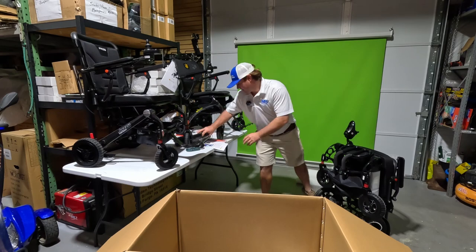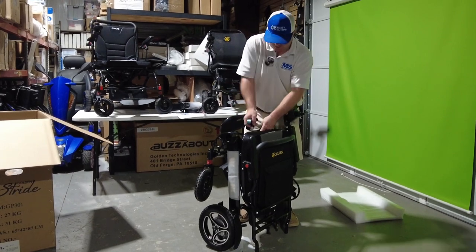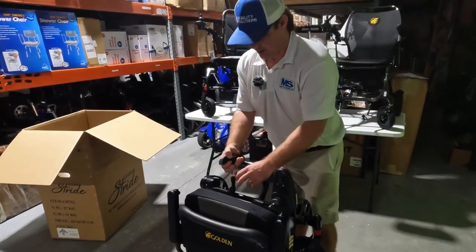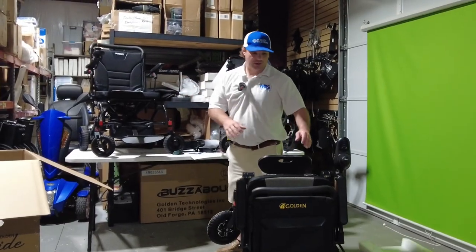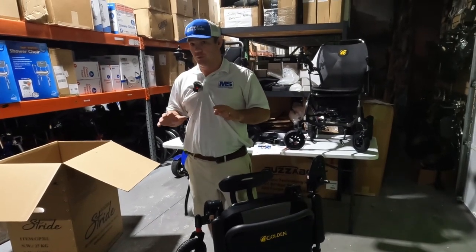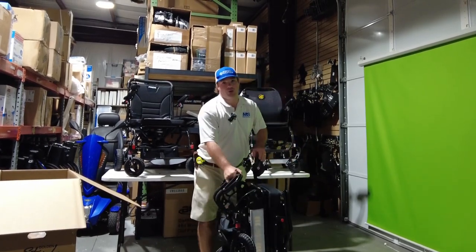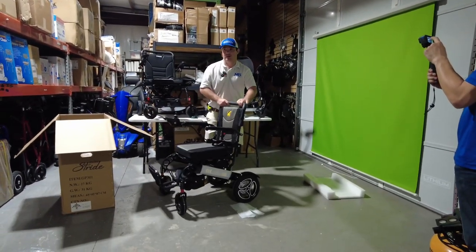They say this weighs 52 pounds — that's probably without the battery. The battery's not very heavy, it's probably four pounds. We're at 53 pounds on the scale. For some people that's going to be very heavy, but performance-wise this is going to outdo both of these units. If you need something for the yard and someone can pick up 52 pounds, you're probably going to like this one — and it's about $1,000 cheaper.